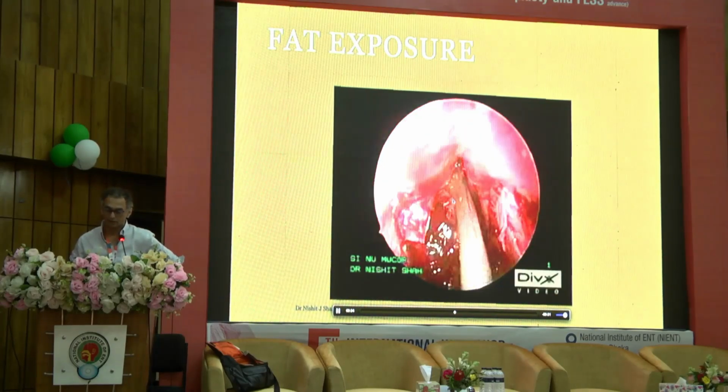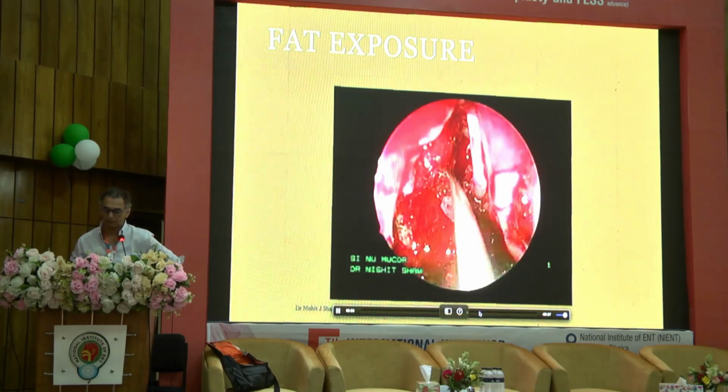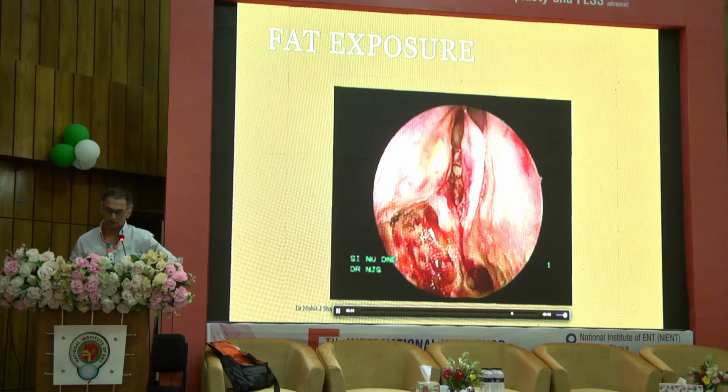And you can see that at the end of surgery, even in the post-op period, so that's just the Surgicel covering it, it looks all right, it heals well. The maxilla, of course, is bare because it was a fungus patient.